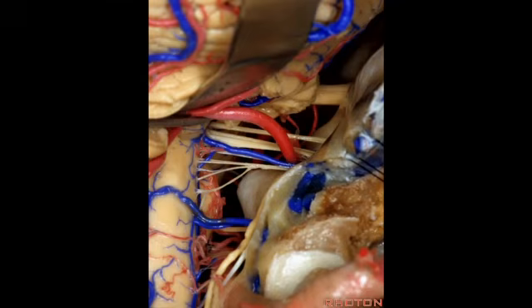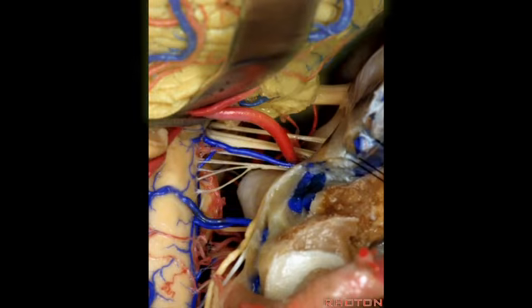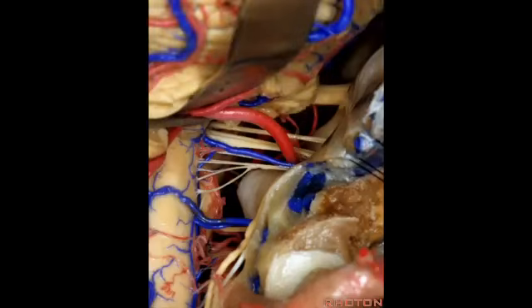And then the veins that you want to watch for down at 9, 10, 11 are these inferior petrosal veins, and they're often mixed in with these nerves. And whenever I elevate a cerebellum, I look for these, because if you stretch them and tear them and you get a clot around 9 and 10, and you're putting in cottonoids and bipolar, it's easy to damage these nerves. So if I see these veins and I'm going to stretch them, then I usually protect the nerves and just bipolar it and get it out of the way.